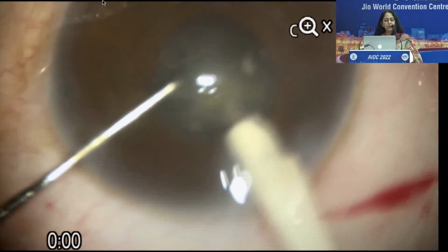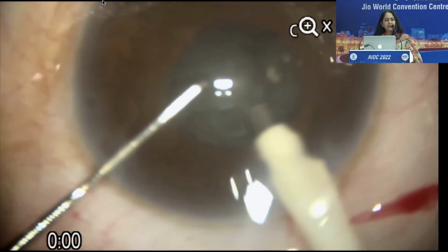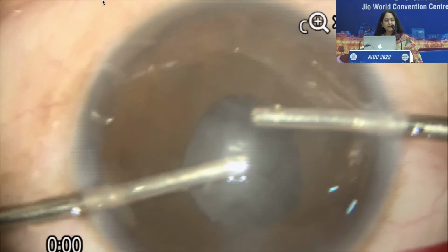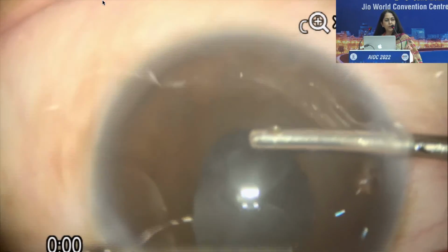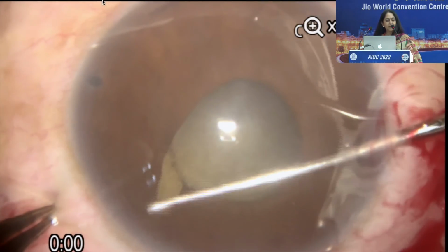The important pearl while doing nucleotomy is to stay safe. These lenses sometimes are very sticky, they do not crack, but you need to keep on teasing them and bringing them to the center. And cortical cleanup also becomes easier if you do a very successful circumferential, systematic cleanup.